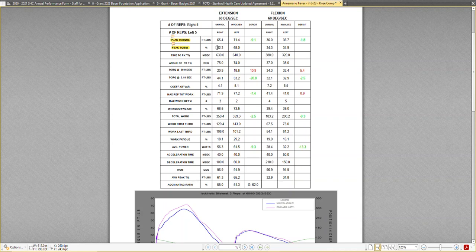So why is this important in a post-injury individual? Let's use the classic example of an ACL or lower extremity injury. Oftentimes even the uninvolved limb can undergo a 30% decrement in its strength because of the hiatus of activity and the lack of training that results from the rehab phase of recovery.